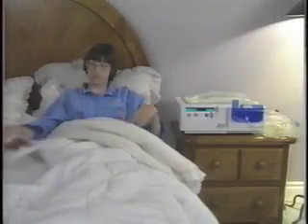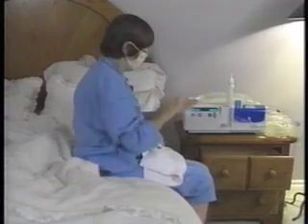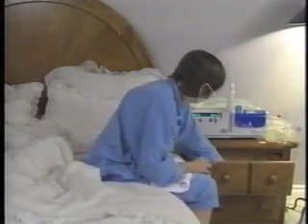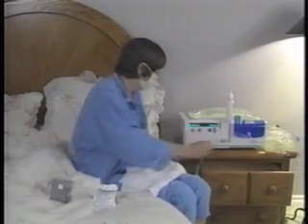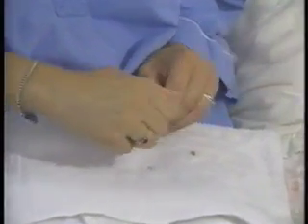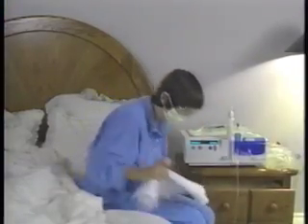If the need arises to disconnect during your therapy, press the stop button. Put on your mask and prepare your hands with the special solution. Close the clamp on your catheter and the white clamp on the patient line. Open the new mini cap and disconnect cap packages. Disconnect your catheter from the patient line, placing the patient line in the organizer. Put the new mini cap on your catheter, then put the disconnect cap on the patient line. The machine will remain stopped until you return.